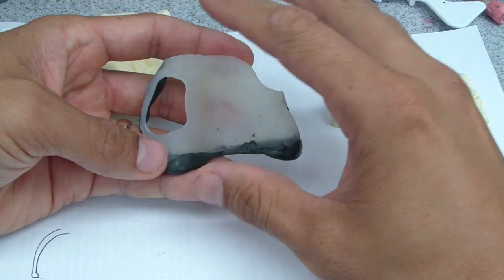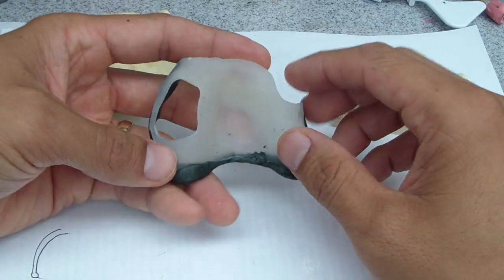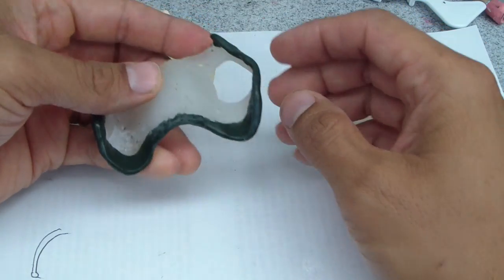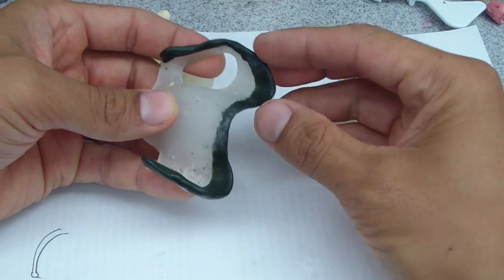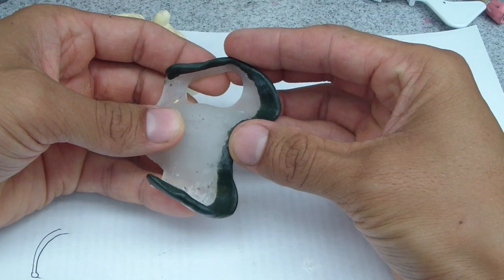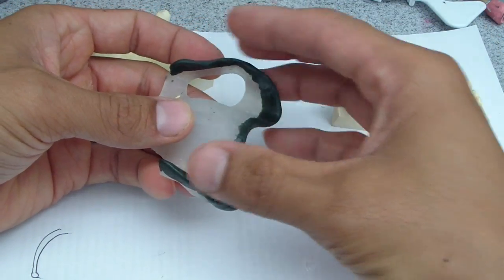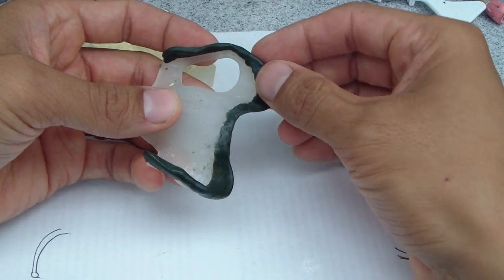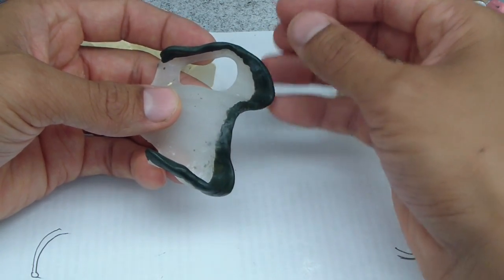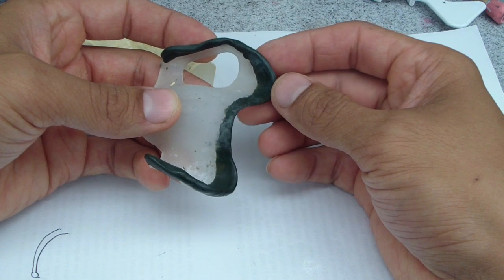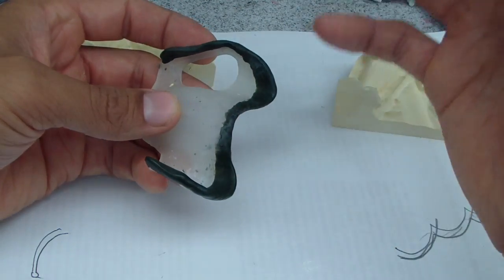Then we're going to pick this up with an alginate impression. So this is just at the stage we did border molding, started at the posterior aspect, one piece here for border molding, another piece here, and we slowly move, in this case front to back, to prevent the amount of compound that gets contacted by the warm water before we place it intraorally.